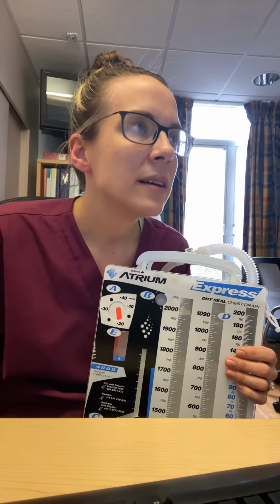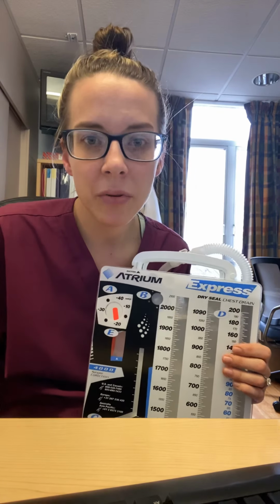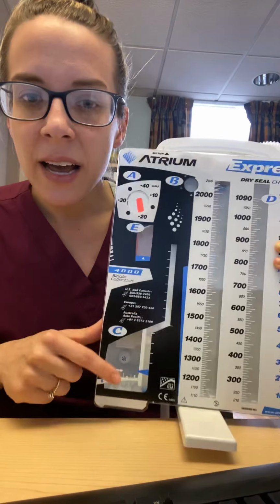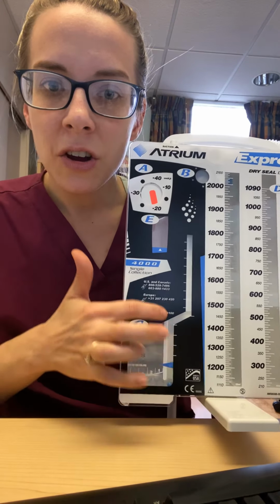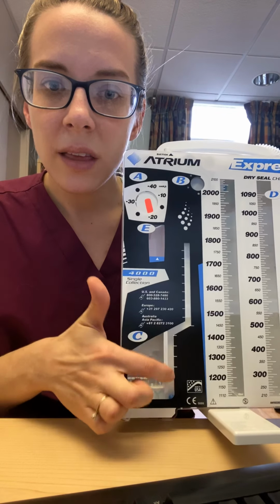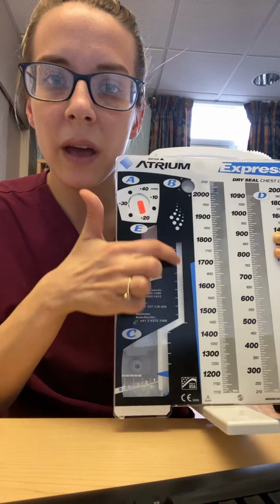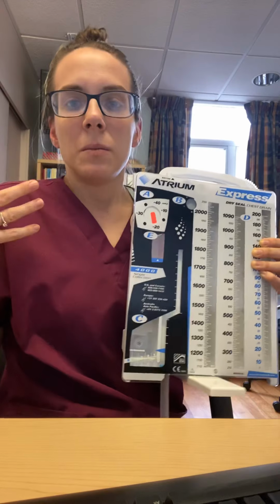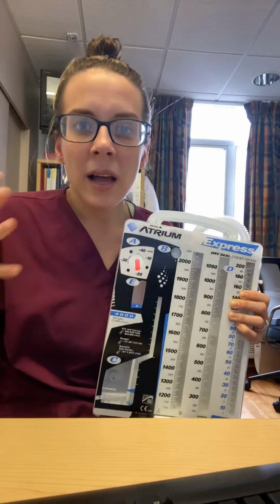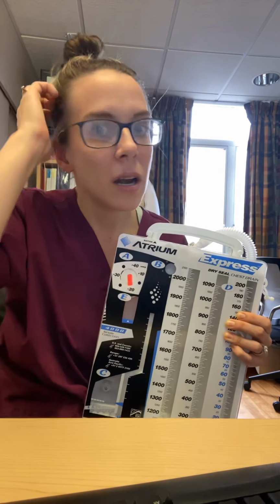Okay, tidaling. This is when the water level in the water seal chamber fluctuates with respiration due to changes in the pleural space. If you're at the bedside watching someone breathe, you're going to see the water go up and down in this column, up and down. It might even go all the way up here. That's reassuring you that it's in the right spot. It's fluctuating with changes in pressure during inspiration and expiration.